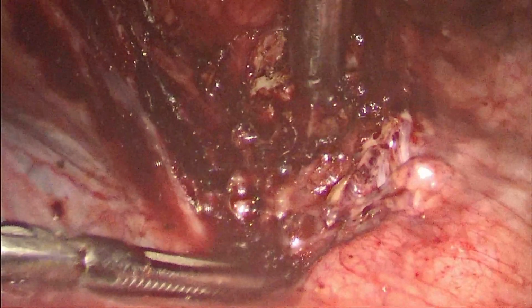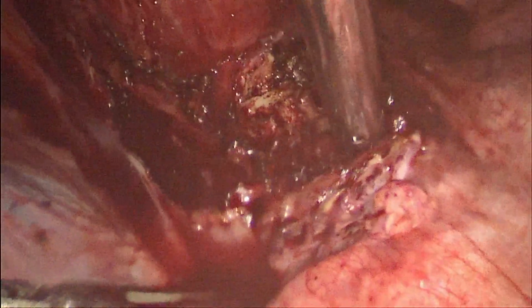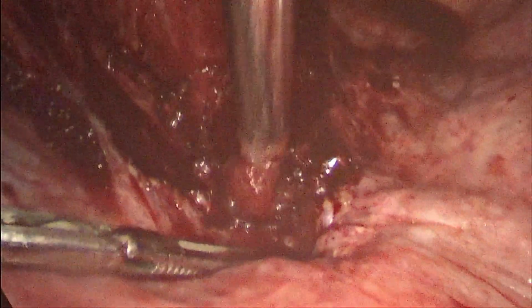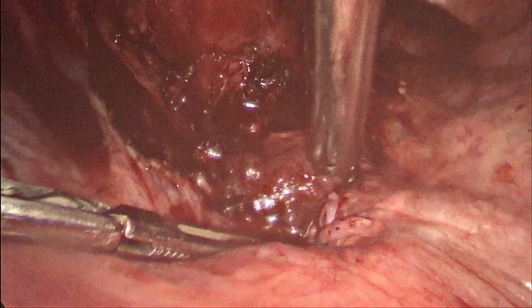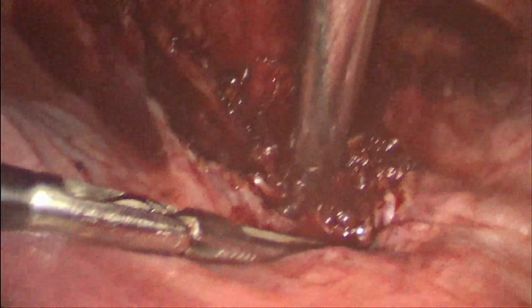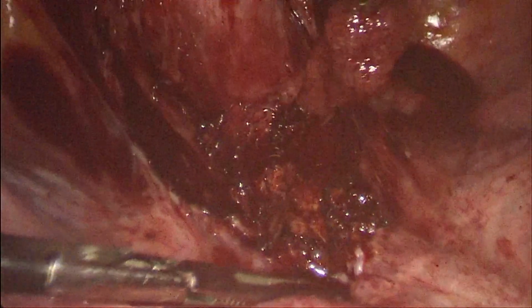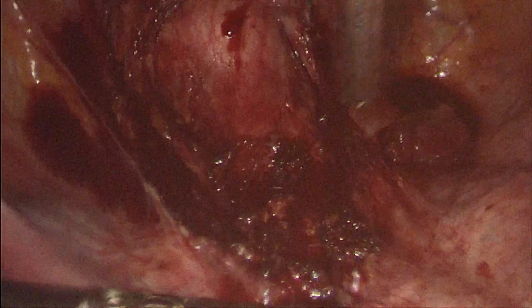We should aspirate all the contents so that there is no persistence of the chorionic tissue and it should not continue to grow again. So we can identify that those are the products of conception. So it has been excised in toto.